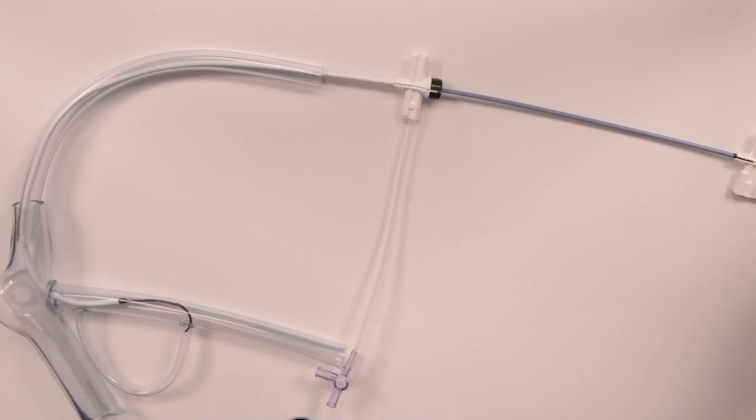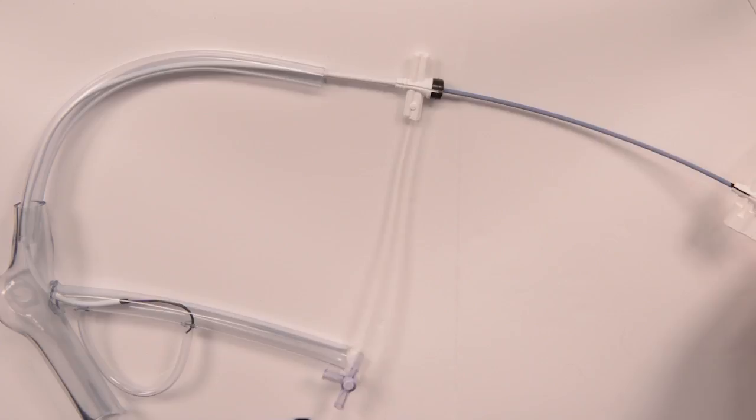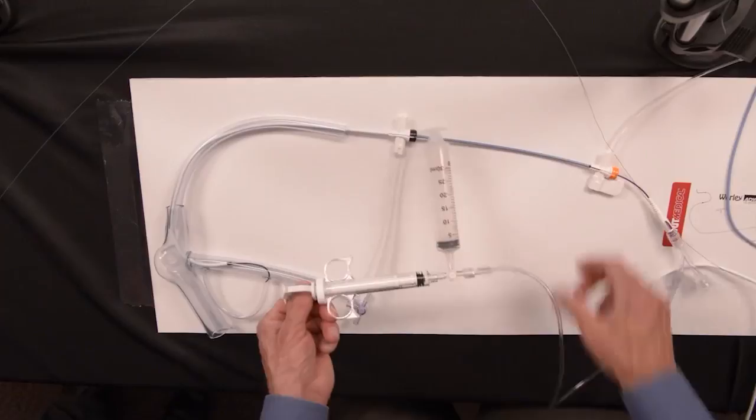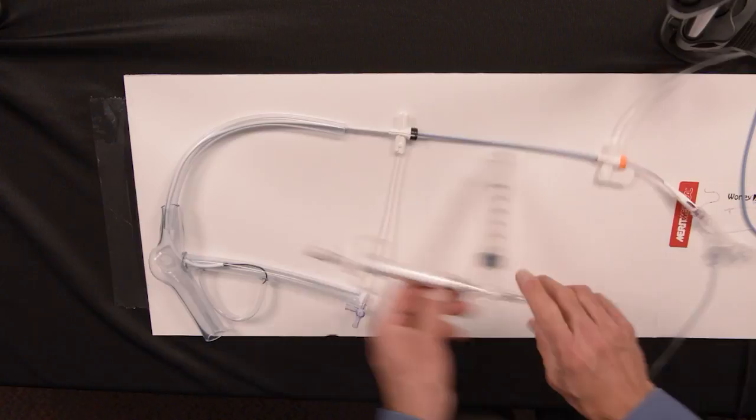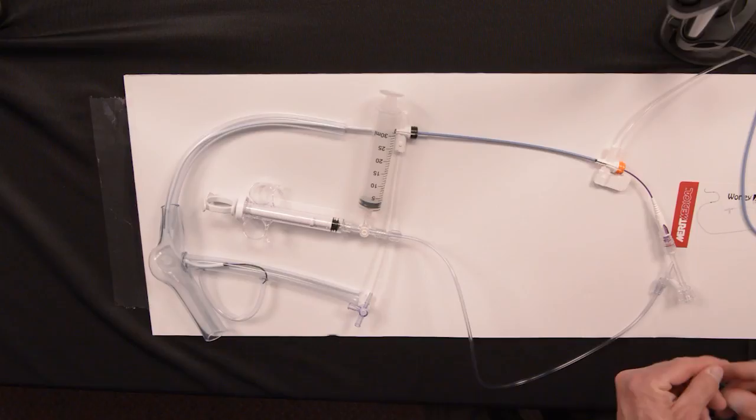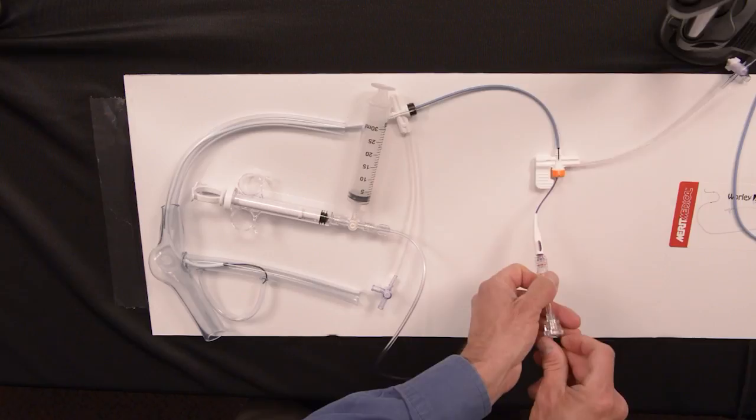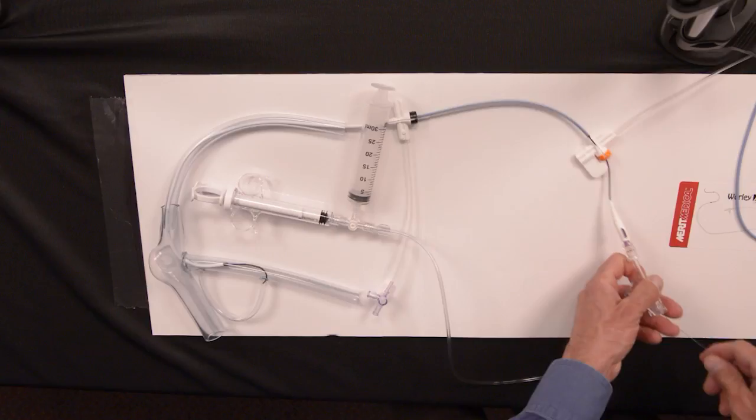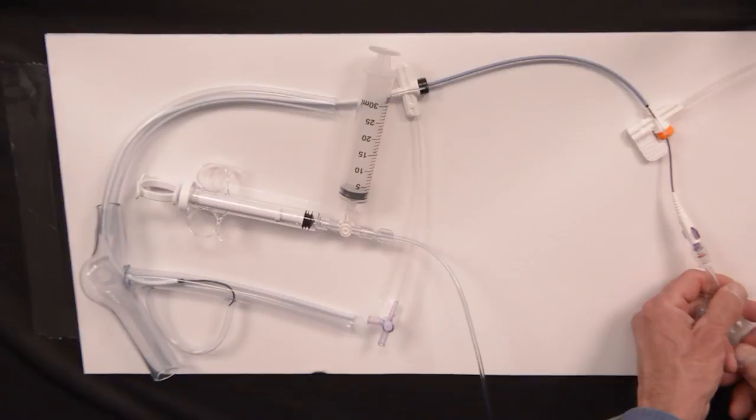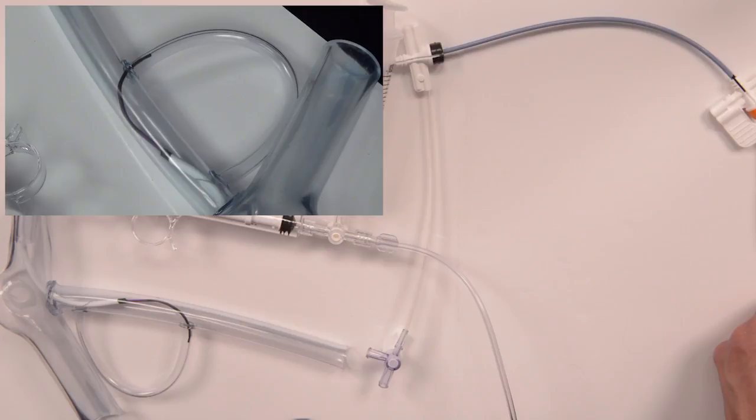I'm going to connect the contrast administration kit that I previously had connected to the braided core to the end of the purple catheter. From here I'm going to take an 014 floppy wire and put it through this valve that comes with the contrast administration kit. Once you look at the tip of the vein selector, you're going to notice the 014 wire coming out, traveling inside that posterior lateral branch.